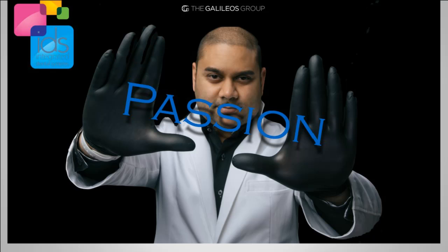And the future of dentistry is certainly going digital with all of the technologies that we have available, spreading from laser dentistry, CAD/CAM dentistry, cone beam imaging for 3D diagnostic imaging for our patients, to using digital x-rays as well. So the technology these days is one thing that certainly allows us to elevate our clinical skill set, but perhaps one of the biggest discussion points in integrating digital technology is how to actually allow the technologies to work together for a more seamless and simplified workflow as it relates to restoring implants.